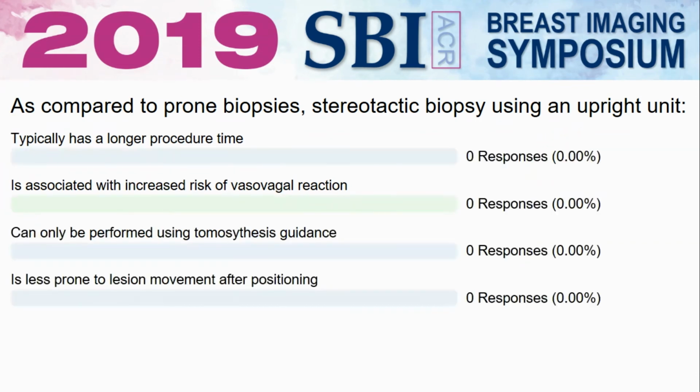And we'll see, nobody's probably answered. Okay, so how many are going for typically has a longer procedure time? Nobody likes that one, okay. How about associated with an increased risk of vasovagal reaction? That seems to be a popular answer. If you didn't raise your hand, you might want to raise. No, I'm just kidding. All right, how about can only be performed with tomosynthesis guidance? Okay, and how about is less prone to lesion movement after positioning? Okay, we got a smart group here. Clearly, risk of vasovagal reaction is the correct answer on this one. Okay, great.